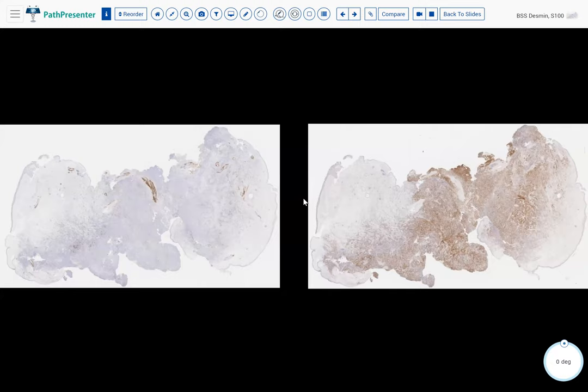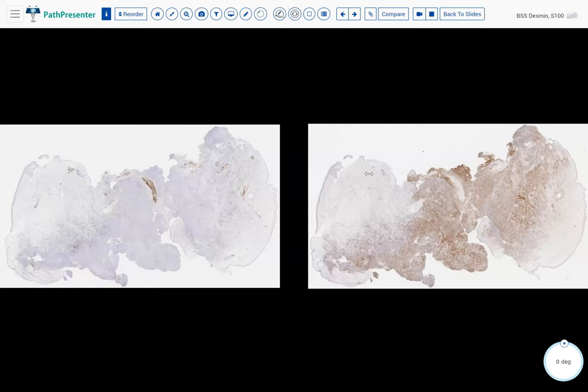The first thing we do is define lineage. We don't just throw 15 stains; we have to answer specific questions and know the limitations of our immunohistochemistry very well. After the basic questions — is it reactive or neoplastic, benign or malignant — the next step is: is it melanocytic, hematolymphoid, epithelial carcinoma, or mesenchymal/sarcoma? Based on the morphology here, I would favor a mesenchymal tumor.